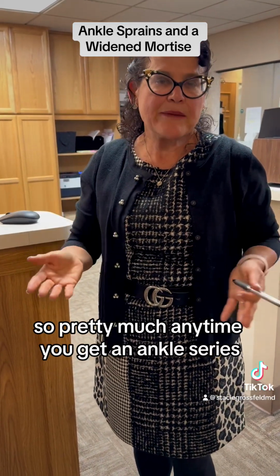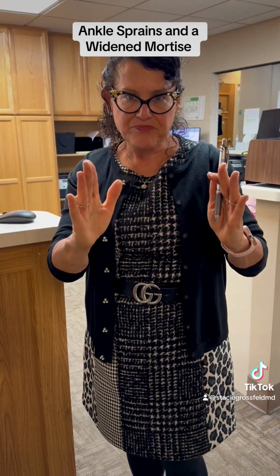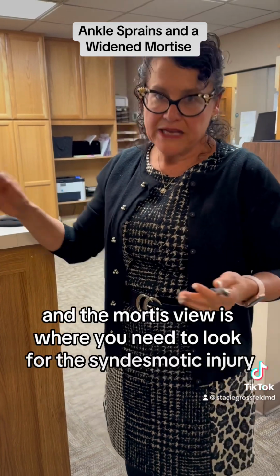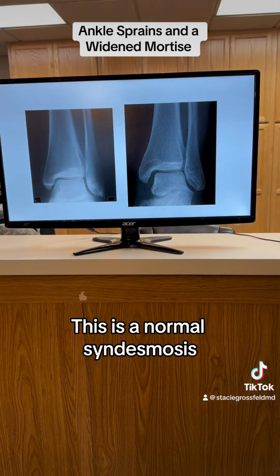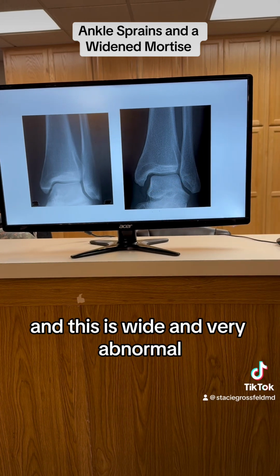So pretty much anytime you get an ankle series, if you ask for an ankle series, you're going to get an AP, a lateral, and a mortise view. And the mortise view is where you need to look for the syndesmotic injury. So this is a mortise view. This is a normal syndesmosis. This is another mortise view, and this is wide and very abnormal.